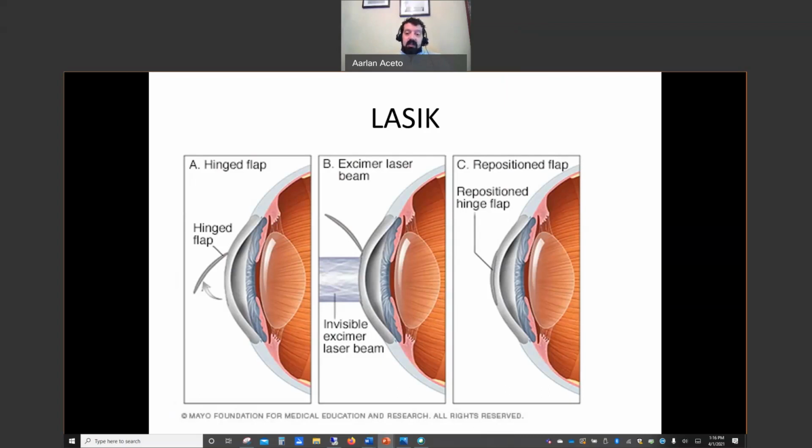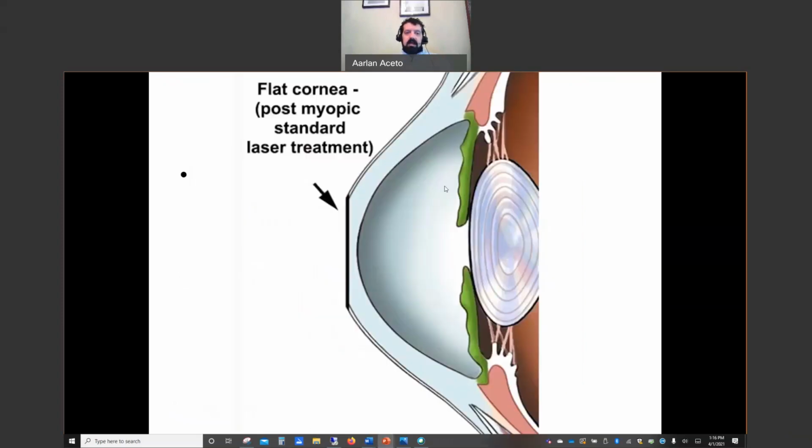And that essentially is how we go for people who are highly myopic. They get LASIK and now they don't require eyeglass lenses. It's not contacts, it's not glasses. We've just reshaped the eye centrally so that they're less myopic. And notice how flatter it is; it would have been much steeper before, but we flattened it.